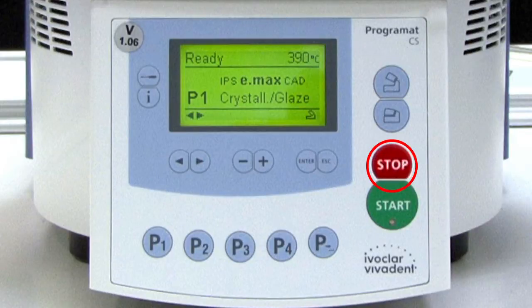The stop key can be used to either pause or completely stop a firing program. By pressing the key once, the program is paused. If the key is pressed twice, the program is completely stopped.